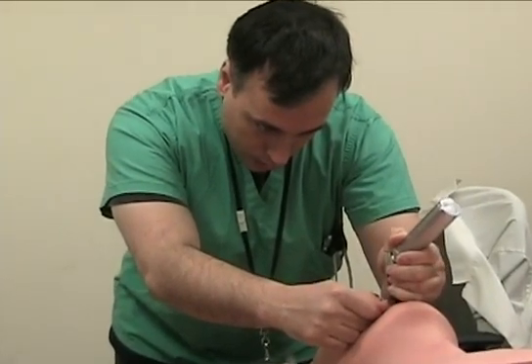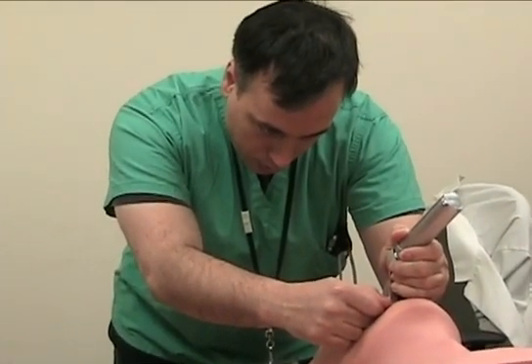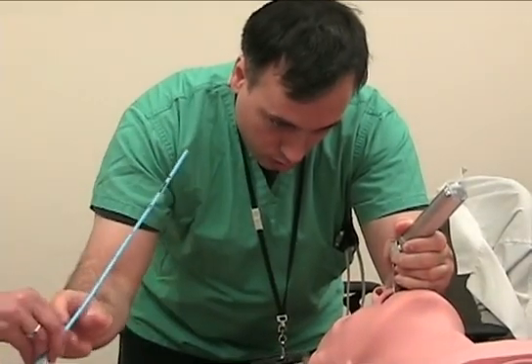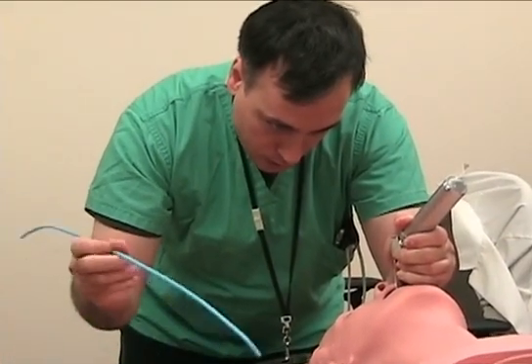We're going to introduce the laryngoscope into the mouth, just like normal, trying to find the epiglottis and get the best view of the glottis you can find. But even if you can just find the epiglottis, you will be able to intubate this patient.